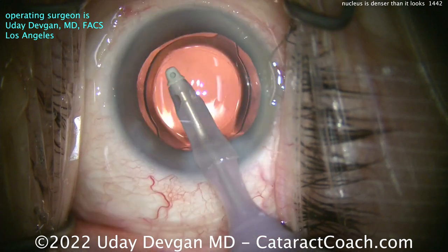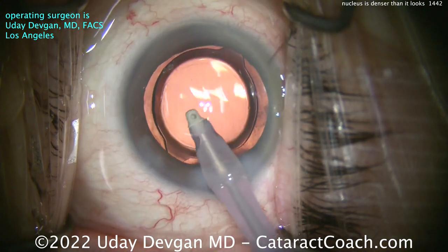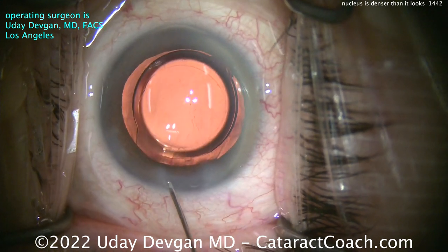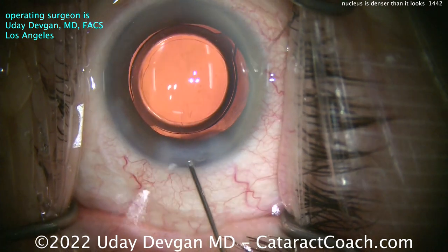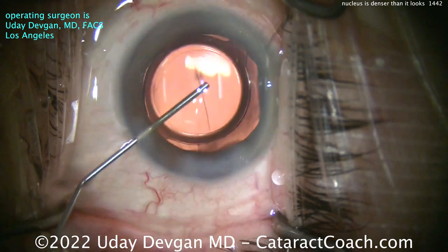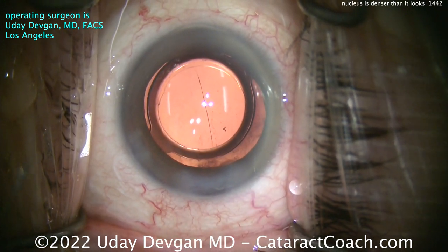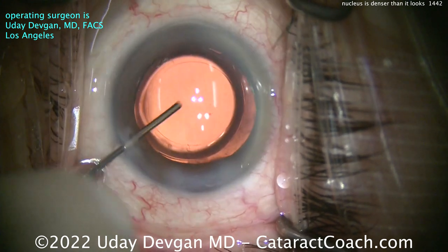Interesting case. The take-home lesson is: be prepared for anything. When you think the nucleus has normal density, don't be surprised if it has increased density — just adapt your technique. I often liken cataract surgery to playing pickup basketball: you have a general idea of what you want to do, but you take it as it comes. You have a host of techniques and skill sets, and you apply them to the case at hand.